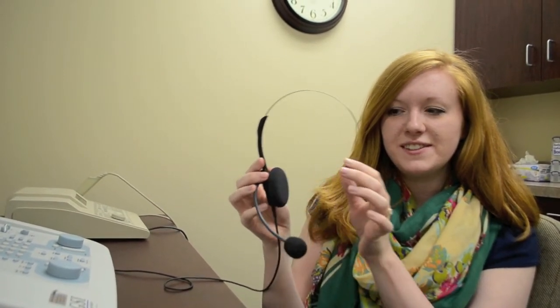Firstly, when using the GSI 61, you will wear this headset. This is important as it allows the tester to hear what the patient inside the booth is saying. It is also necessary so that the patient can hear instructions given by the clinician.